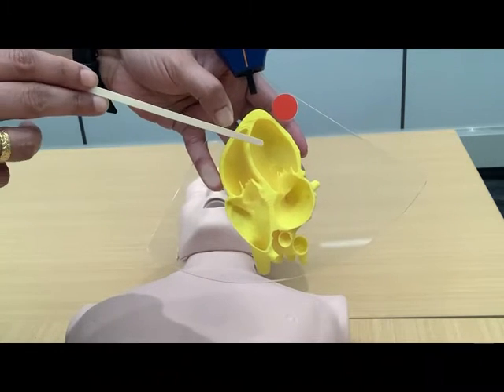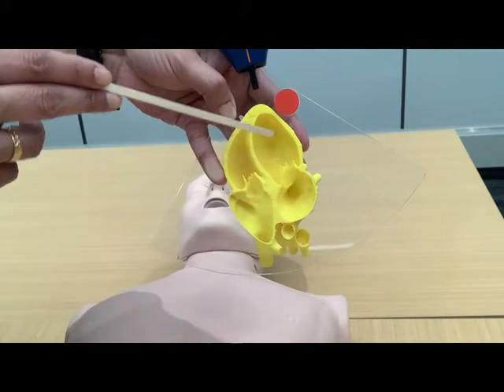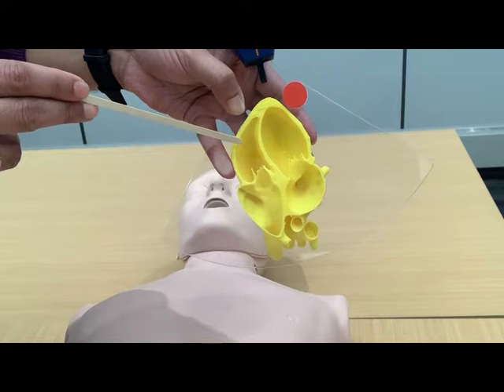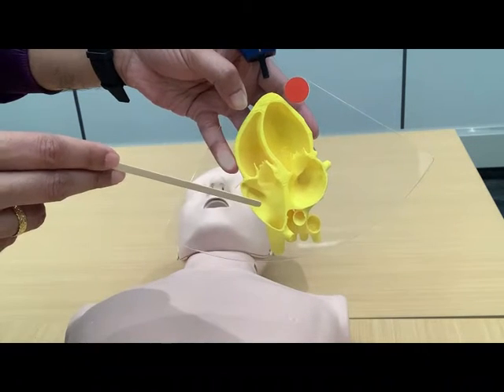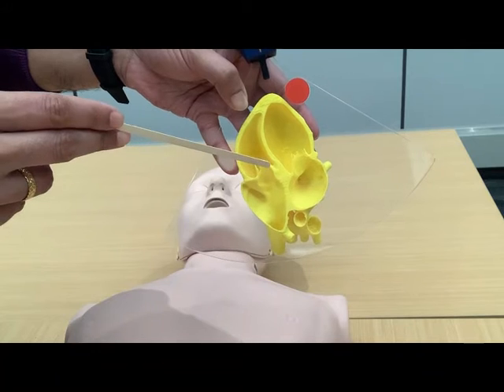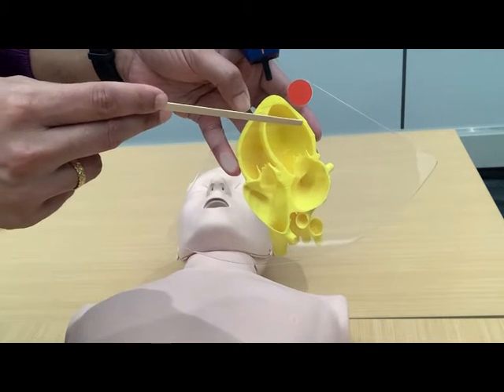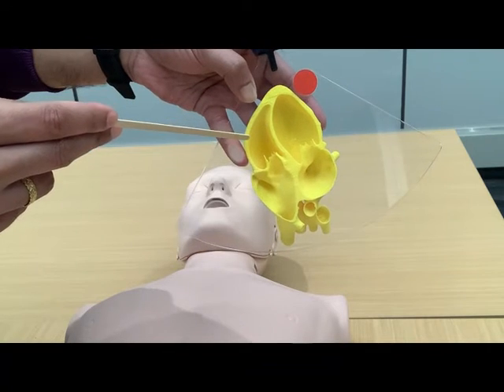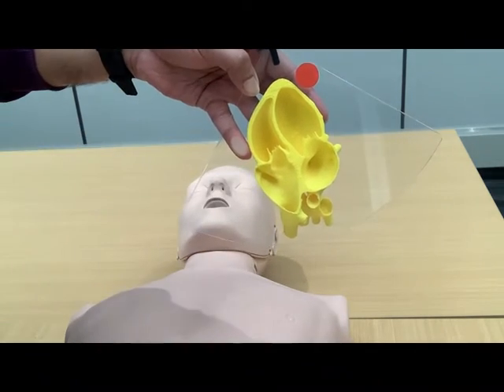Here is the left ventricle and the left atrium that opens into the left ventricle, with the mitral valve between them. This one is the right ventricle and right atrium, and the valve between the right atrium and right ventricle is the tricuspid valve. Normally the left ventricle occupies about two-thirds of the image and the right ventricle occupies about one-third of the image.